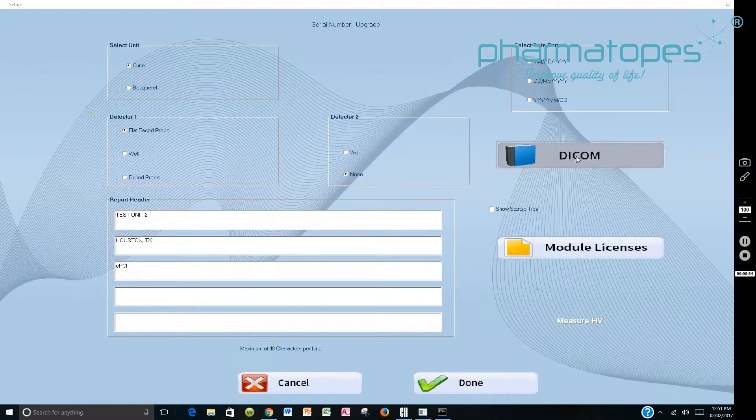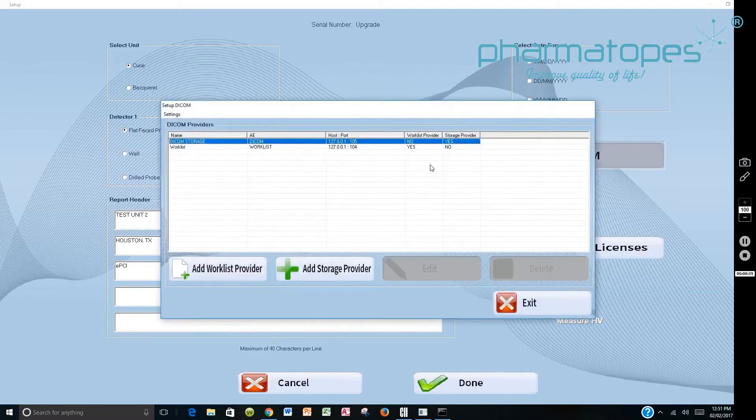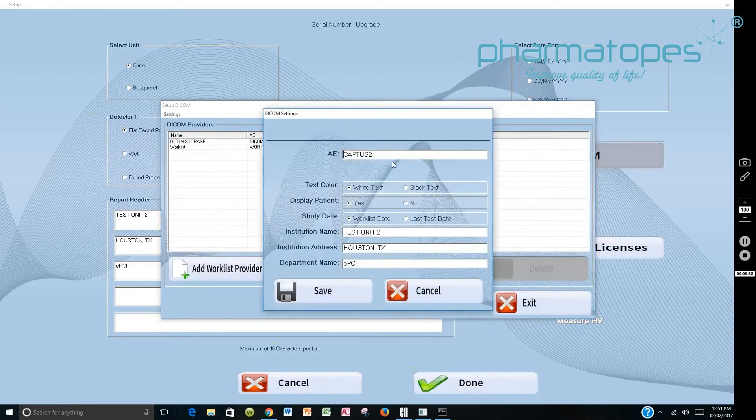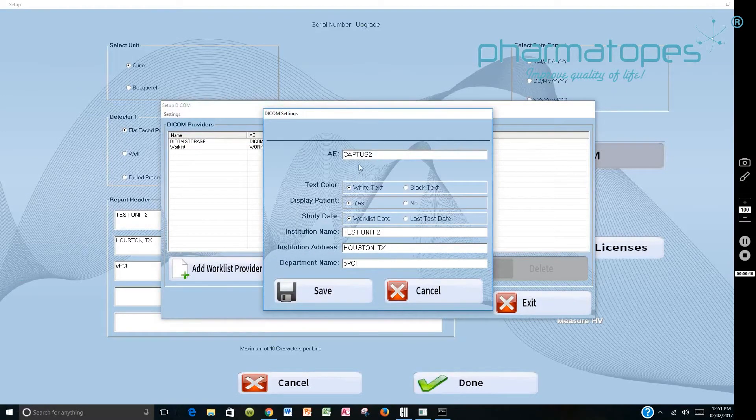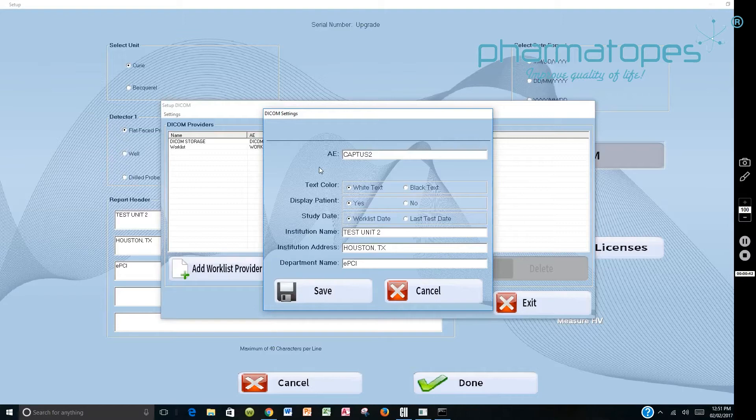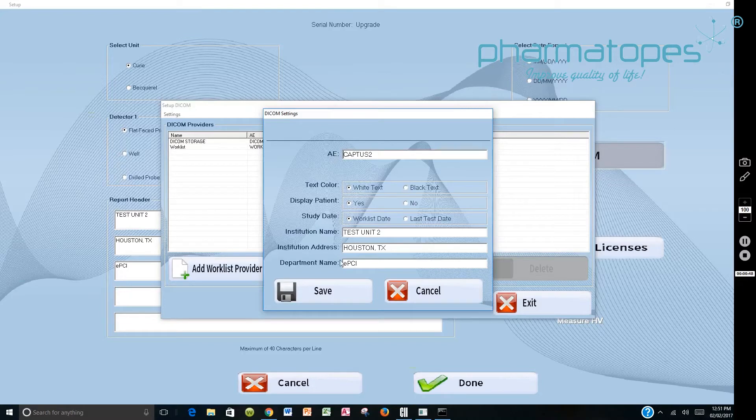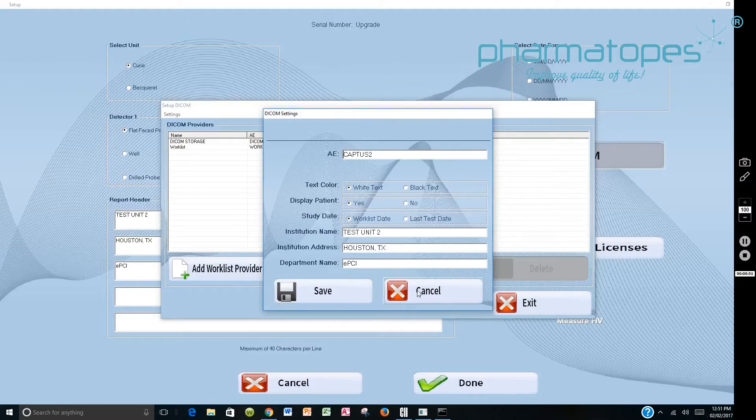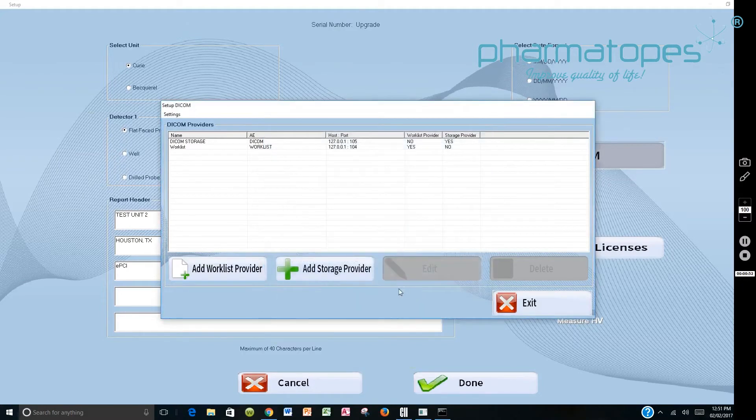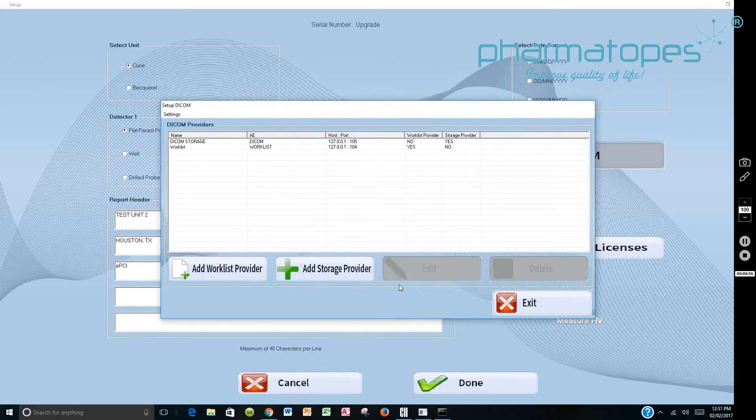Then you would go to DICOM and go to Settings. Now this is blank and you will have to fill it in. You'll have to get an AE title from the PACS Administrator. Once he provides you that AE title, fill that in. Fill in the remaining part of this form and then say Save. That information tells the DICOM server and the worklist provider who you are.